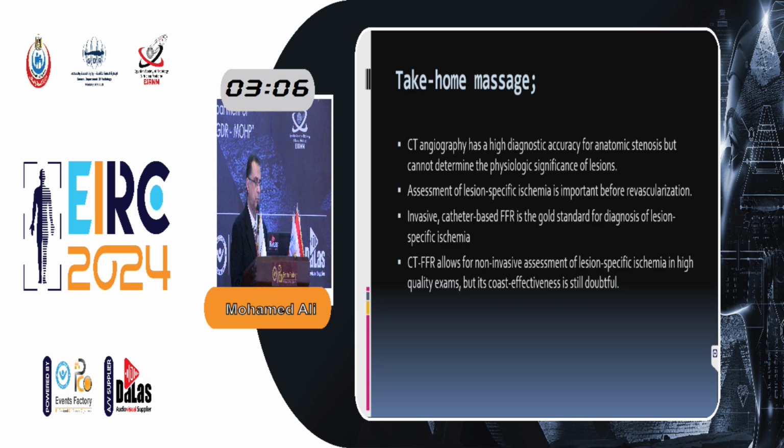CT-derived FFR allows non-invasive assessment of lesion-specific ischemia in high-quality exams, but its cost effectiveness is still doubtful.